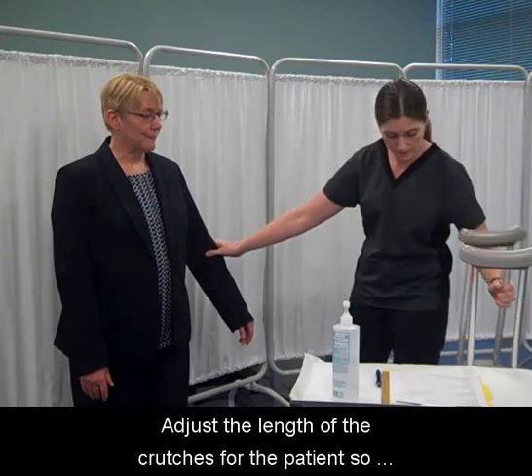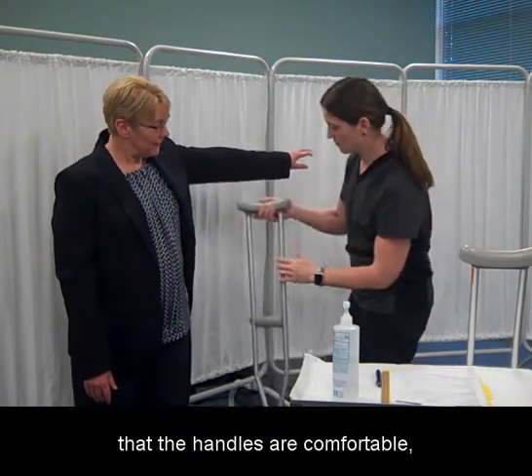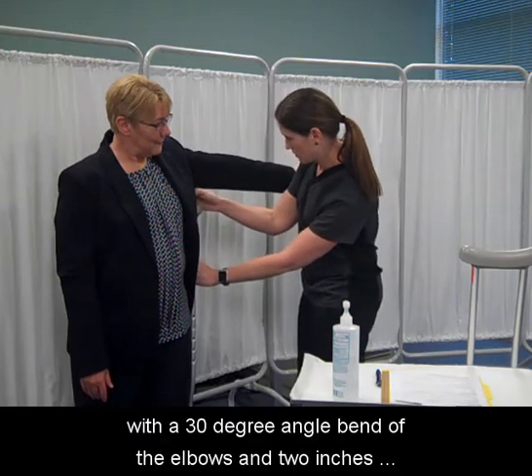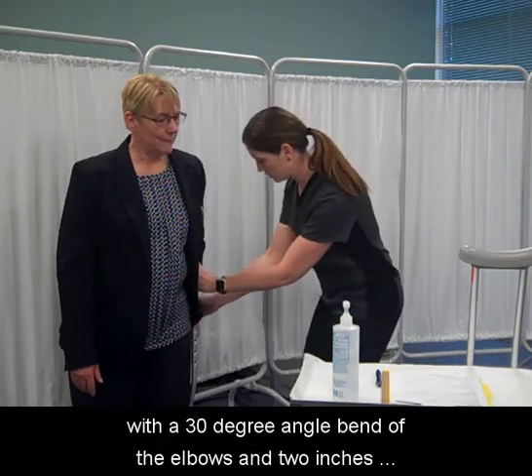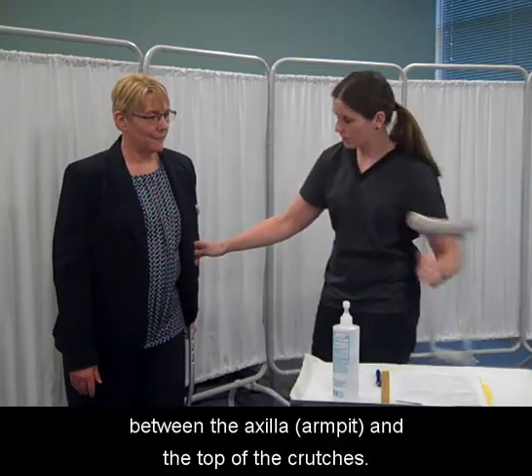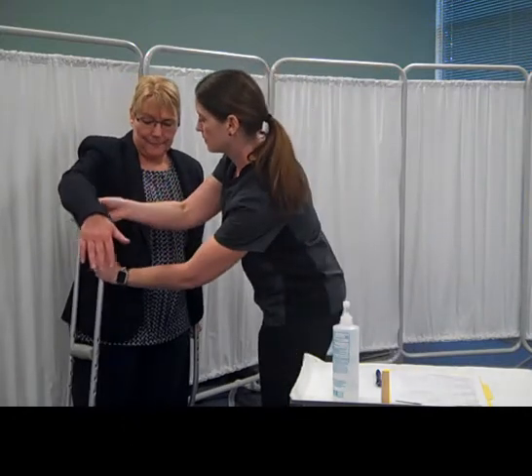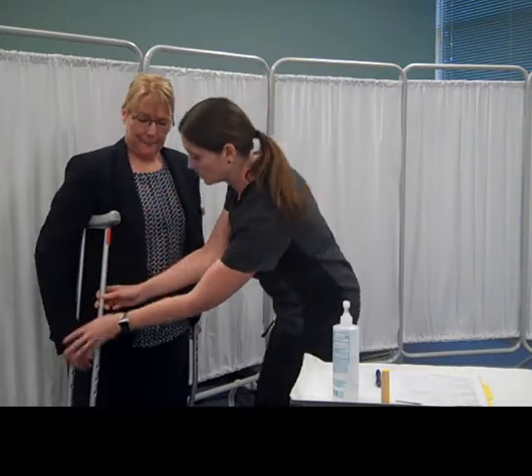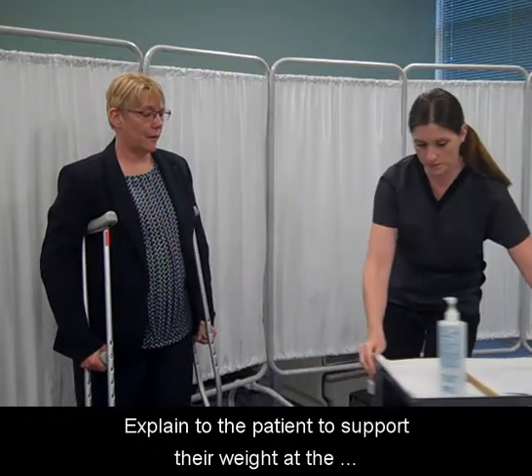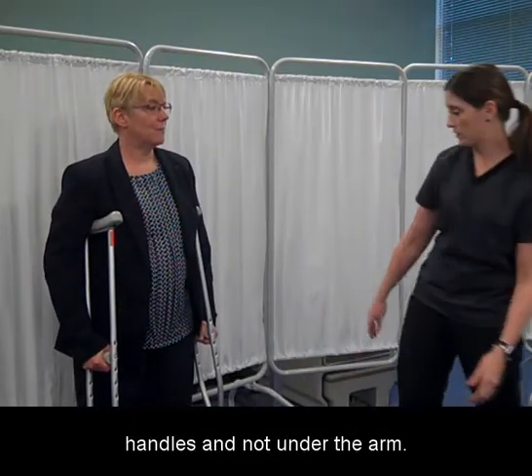Adjust the length of the crutches for the patient so that the handles are comfortable with a 30-degree angle bend of the elbows and 2 inches between the axilla and the top of the crutches. Explain to the patient to support their weight at the handles and not under the arm.